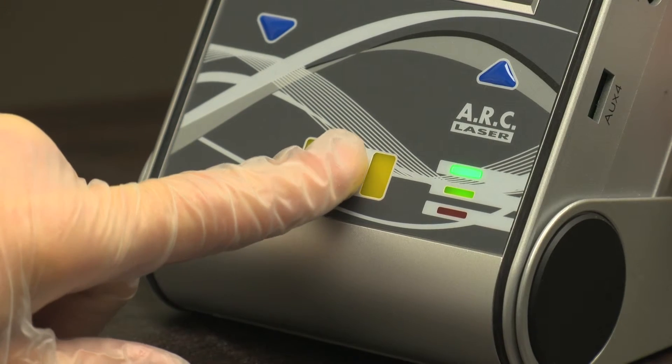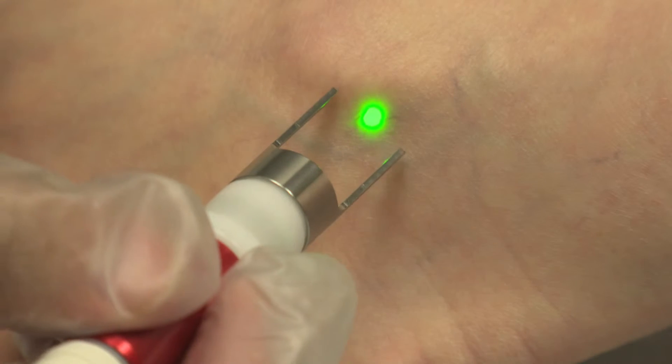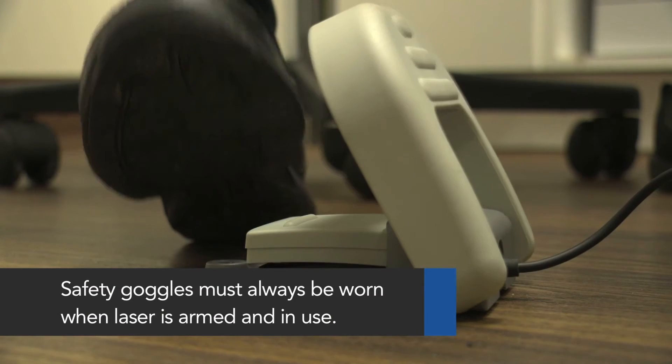Arm the laser by putting the device into ready mode. The laser is armed but not on when the light is solid. The green aiming beam will also appear from the handpiece when the laser is armed. Next, open the safety cover on the foot pedal.